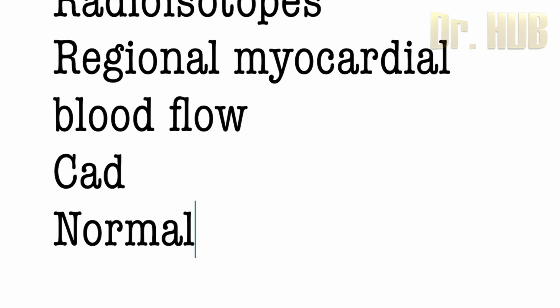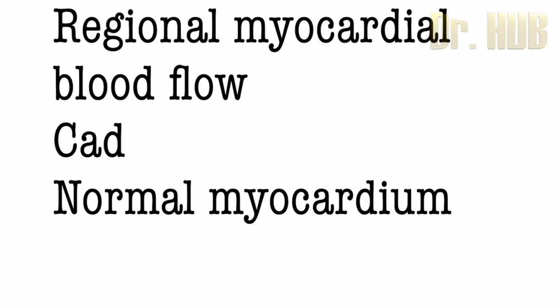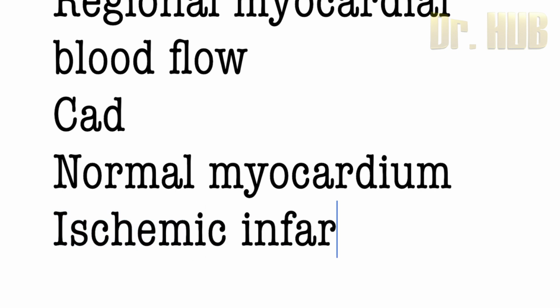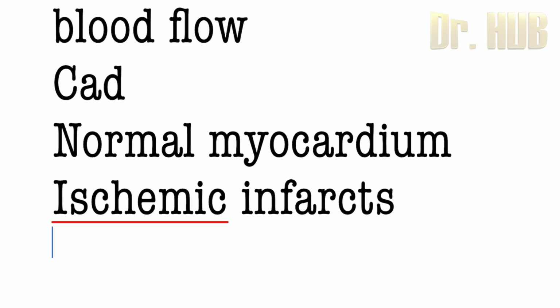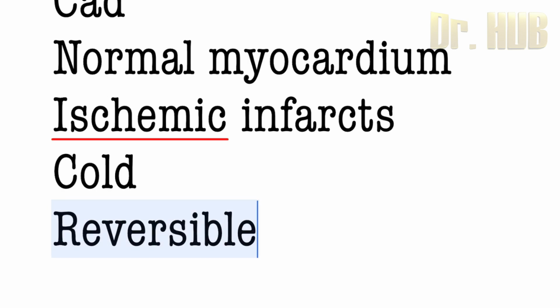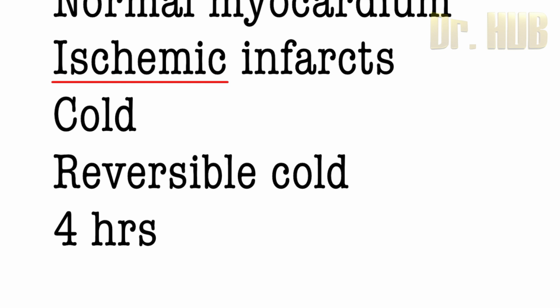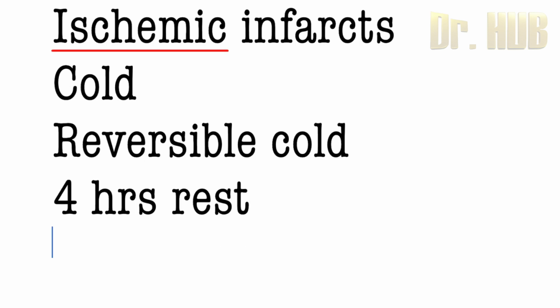Now looking at the normal myocardium, it appears hot, and ischemic infarcts appear cold. The reversible ischemia is indicated by cold spots that return to normal, hot, after 4 hours of rest. In infarcts, after 4 hours rest, it remains cold.